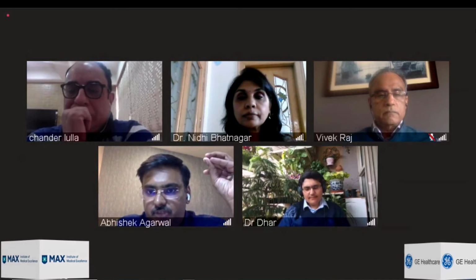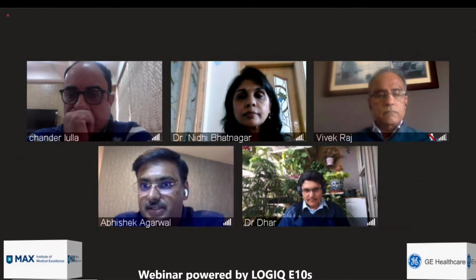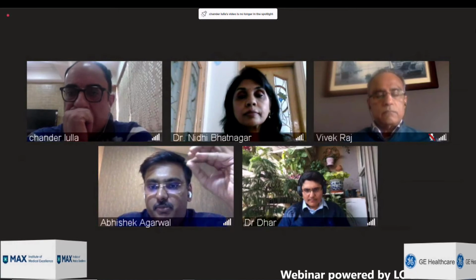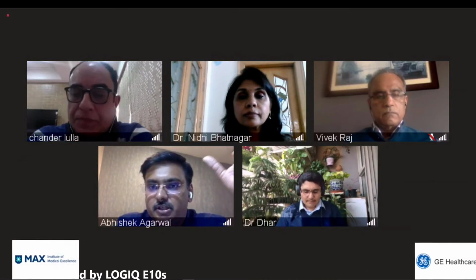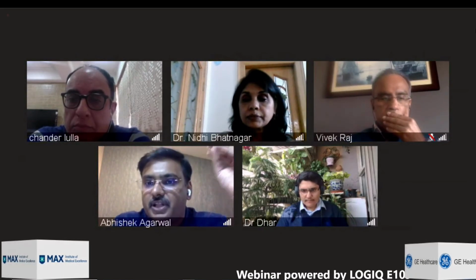Nidhi, am I correct in inferring that ultrasound-based elastography is just transient elastography, or TE, with eyes? I mean, all the benefits of ultrasound-based elastography are mainly because we see where we are going, we see what we're doing. If you don't get into the technicalities of the different machines or vendors or different vibration pulses, for a layman doctor who wants to refer a patient and doesn't know where to send, he should know that the main thing is just a fibroscan with eyes, right?